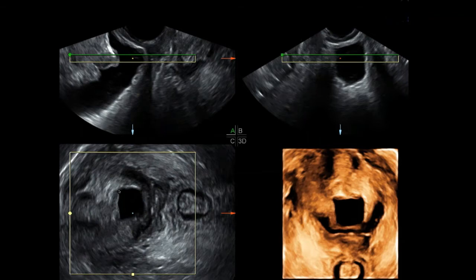So this is exactly a similar case where the bladder has already descended, so it's there. Sometimes if you look at a patient that has a prolapsed bladder, you can almost see it come out of the vagina, and you sometimes have to push it back in to examine the patient, as we did in this particular case.